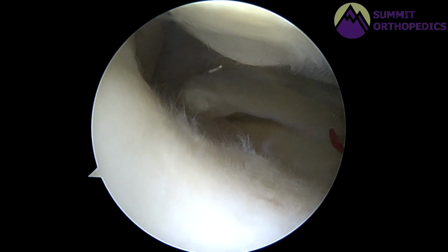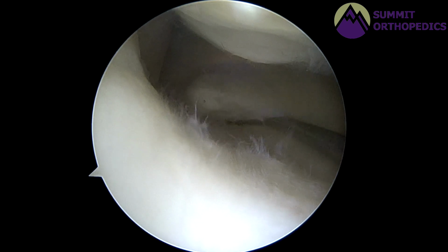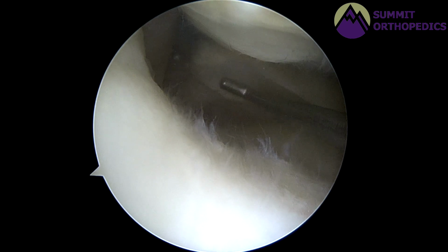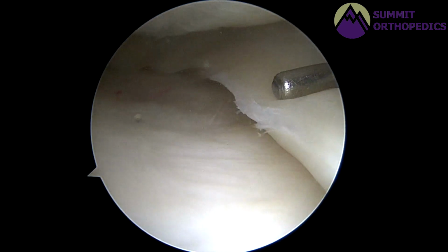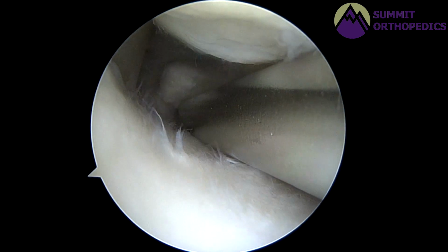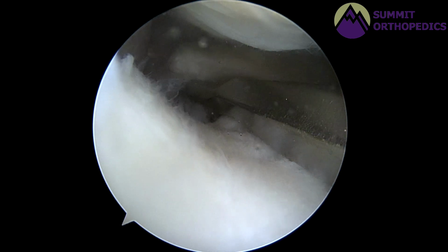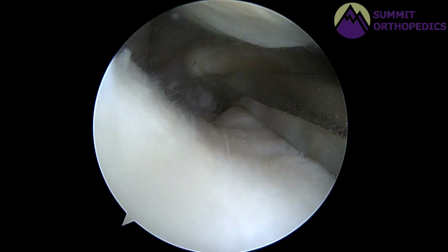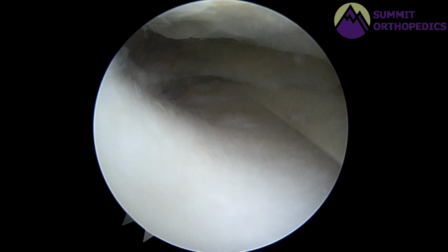This was a 54-year-old male with a medial meniscal root tear. I approached this arthroscopically, so here with the probe, I can displace the torn meniscus tissue from the very back of the knee. The remainder of the meniscus looks very normal. There is a little bit of early arthritis on the femur. I then take the shaver and then a tool called a curette to basically remove the cartilage from the footprint area where the meniscus would attach to create a healthy bleeding surface once the repair is completed so that the meniscal tissue can heal back down to the bone.